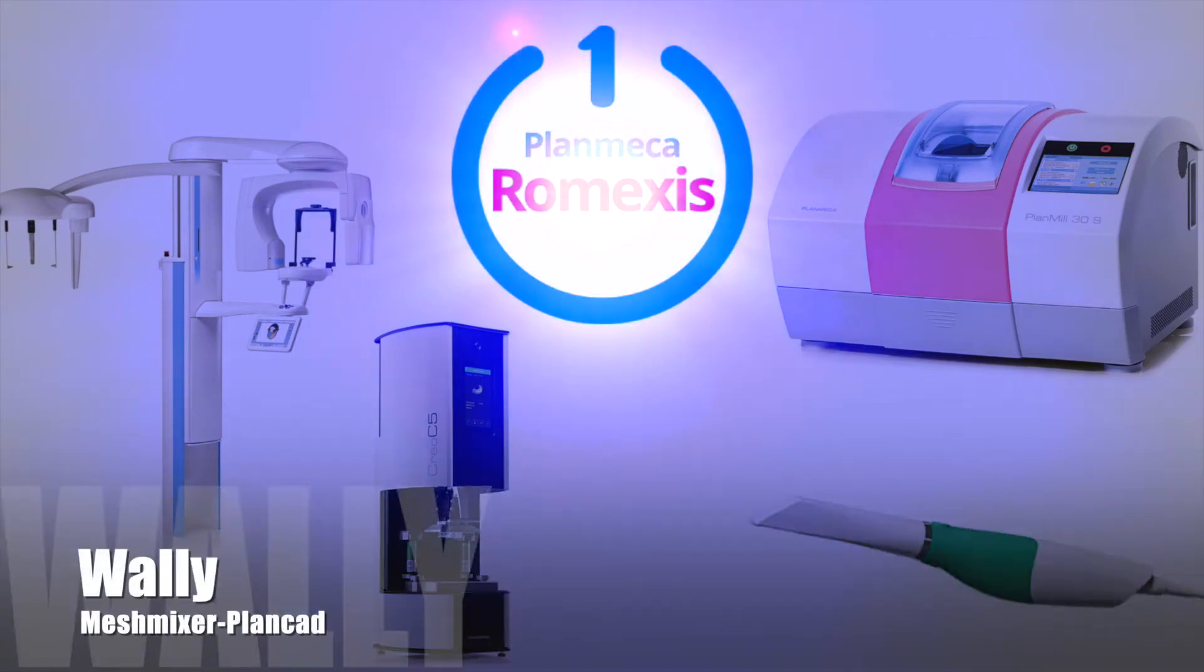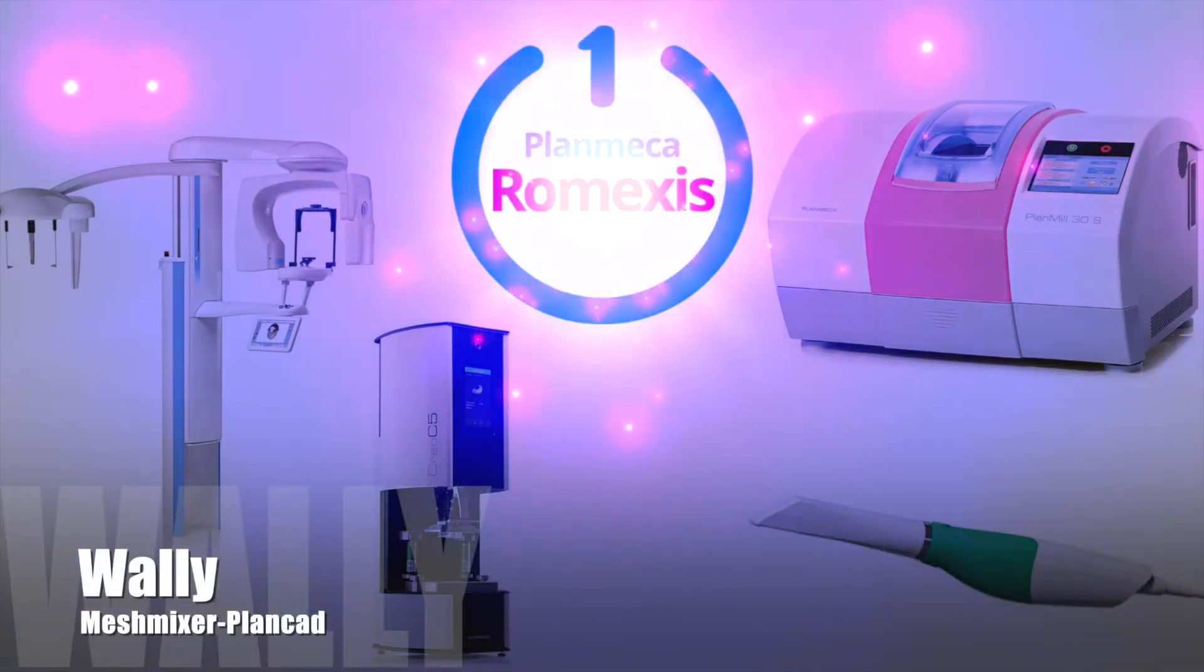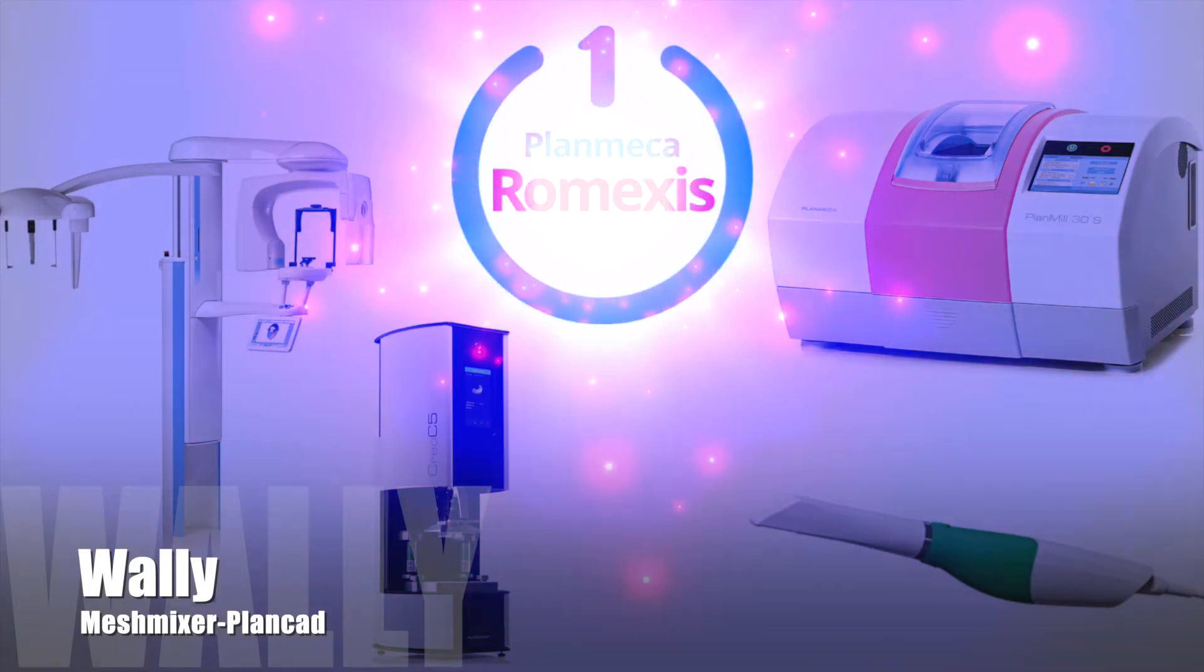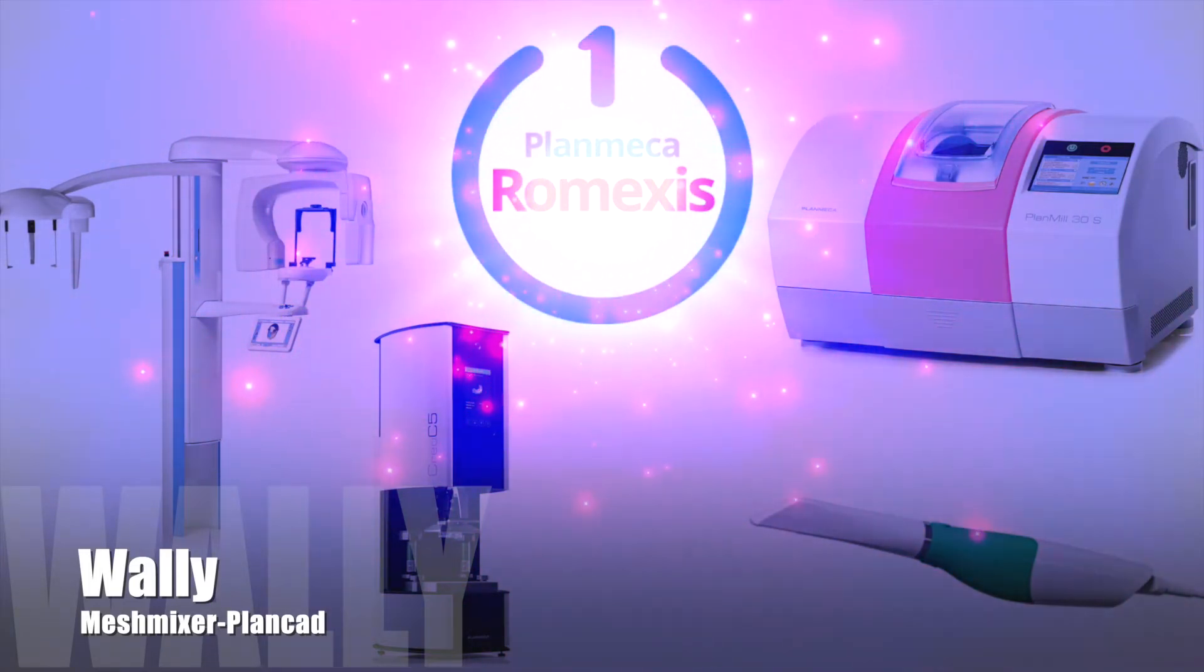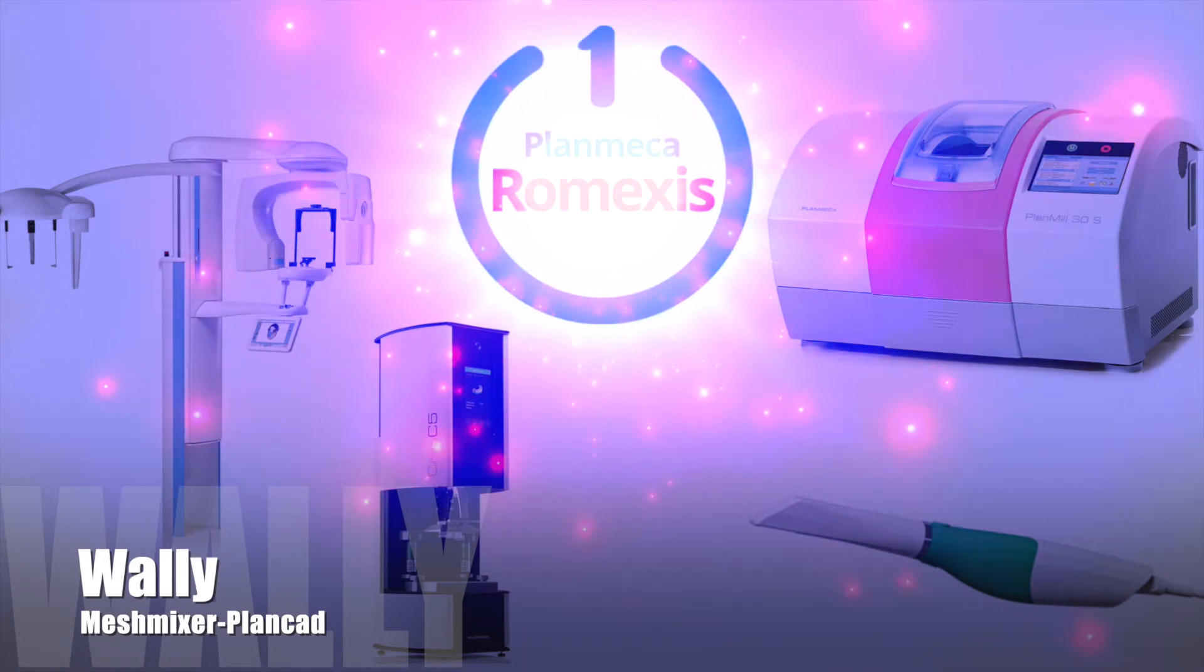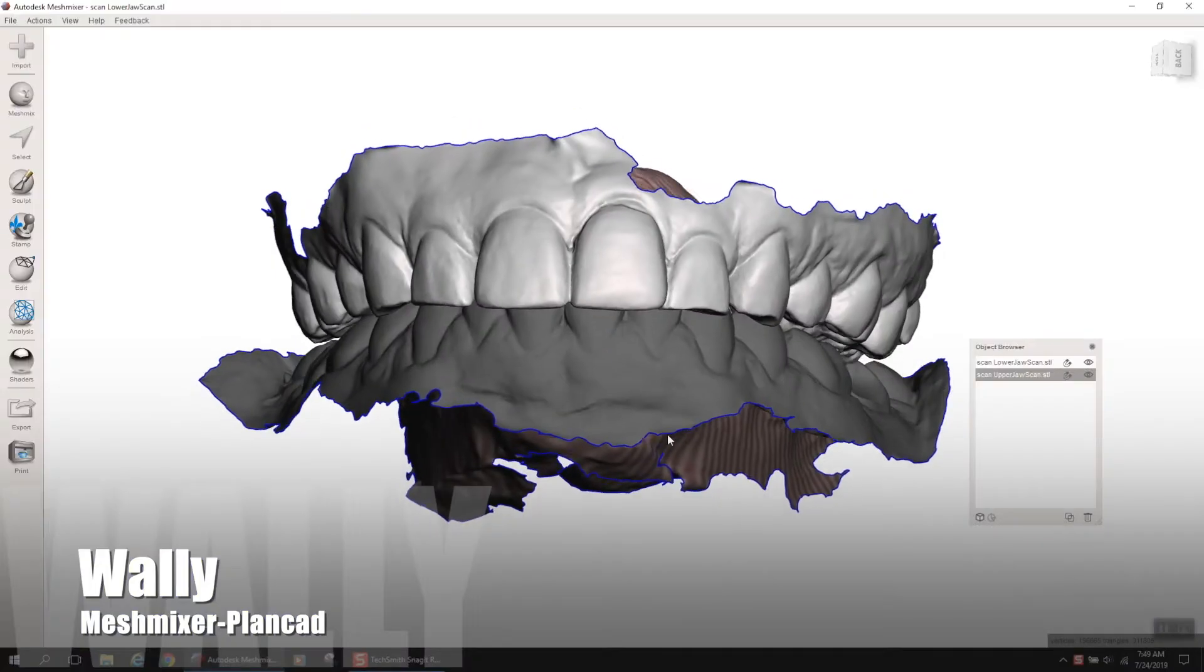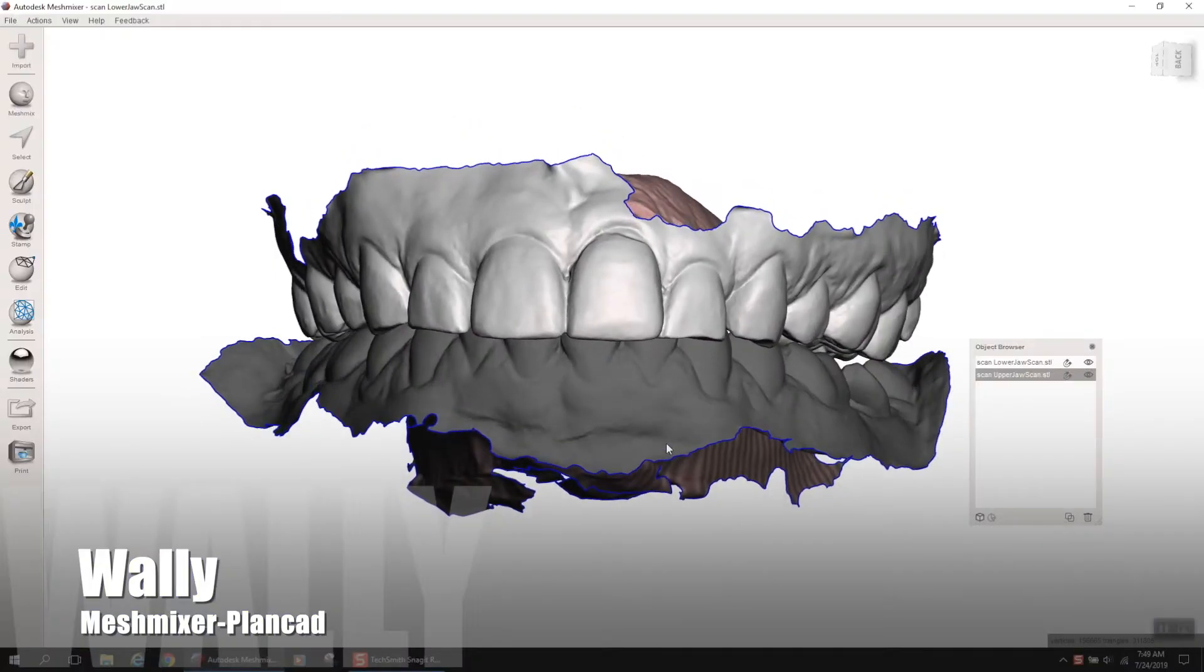Hey guys, Wally Rene here. Just going to do a quick little talk on how to very easily erase a tooth in Mesh Mixer, bring that tooth back into PlanCat Easy, and do something cool with it.